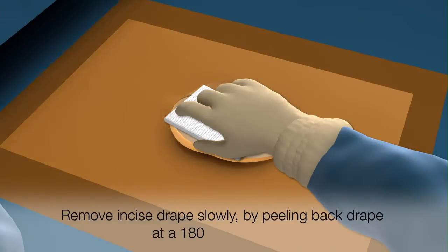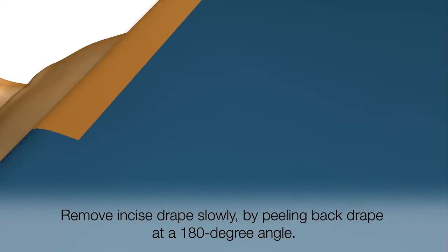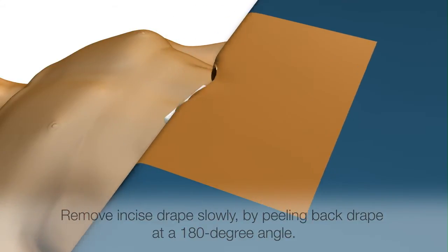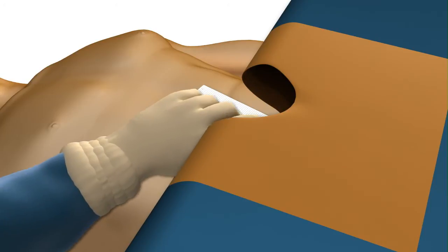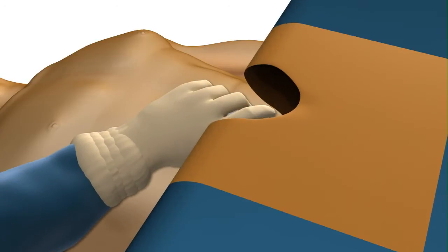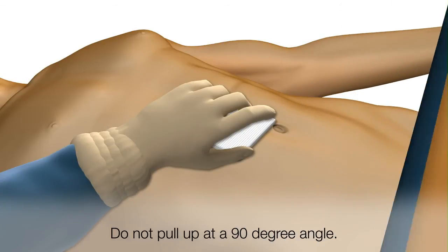It is critical to go low and slow, pulling gently and with even tension, especially around the incision. Do not pull up on the drape at a 90 degree angle.